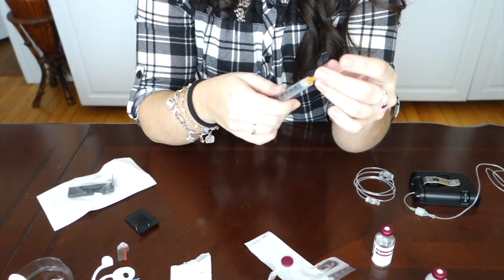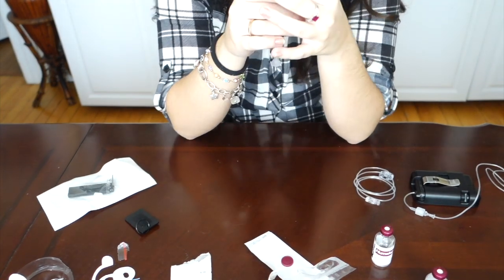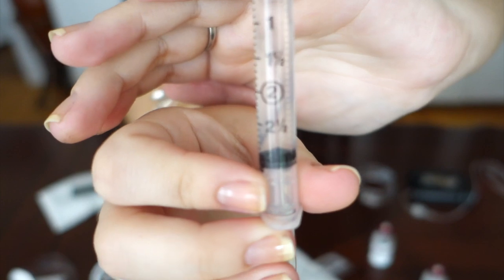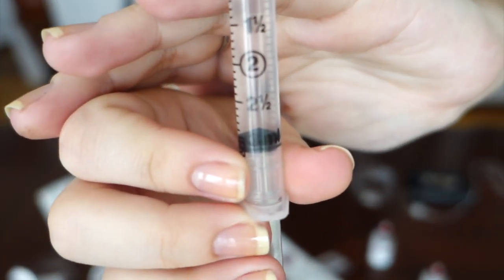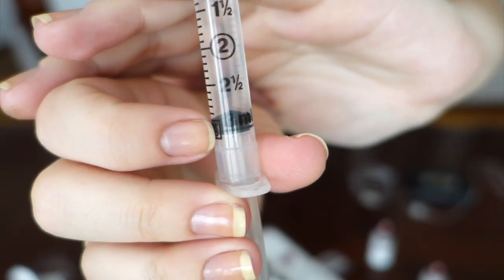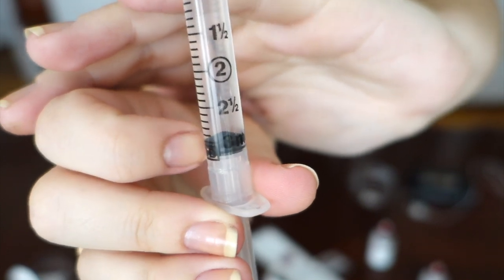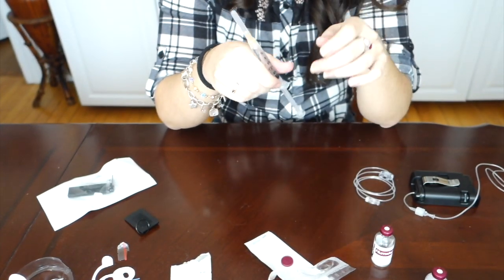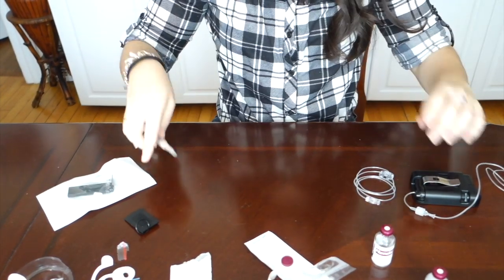Make sure it doesn't have any air bubbles. Everything looks good. I stopped it right there at the three milliliter mark - right where that black ring is, that's where the plunger stops and it's at 300. Now that the syringe is ready with the insulin, I'm just going to set that aside for a second.